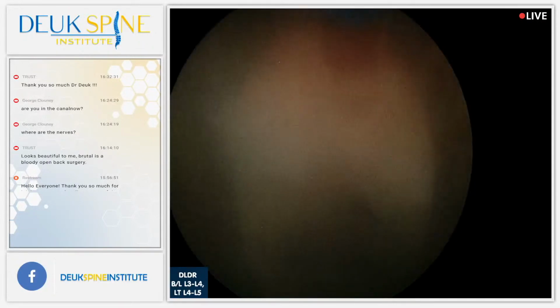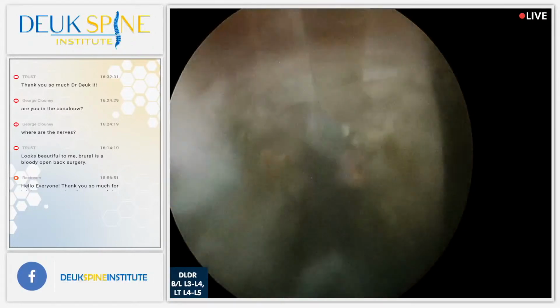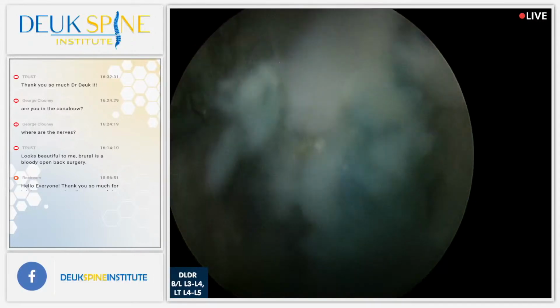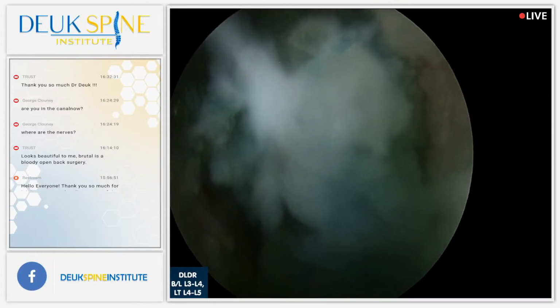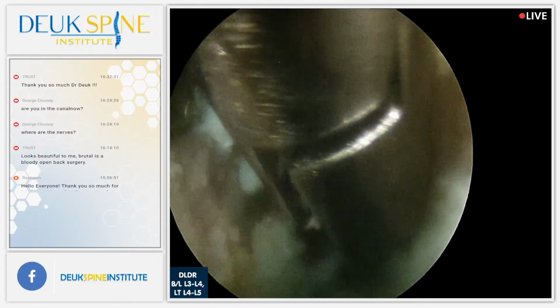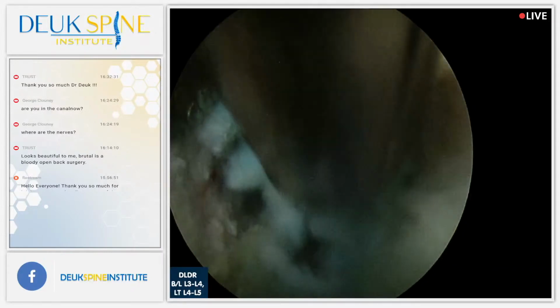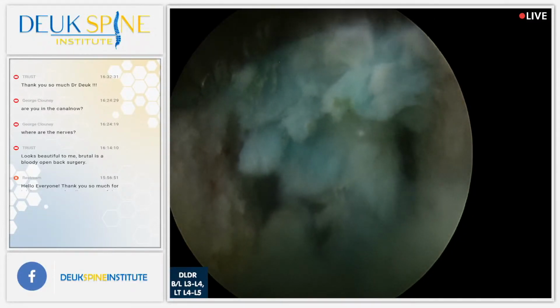Yeah, thank you. Oh, that's a big herniation right there. One piece, small.